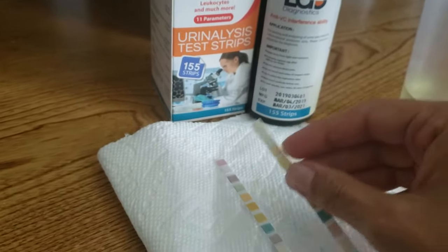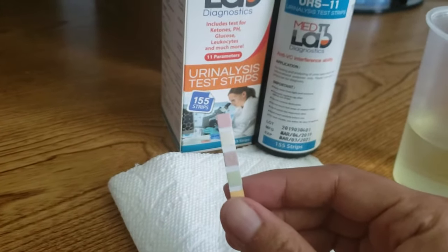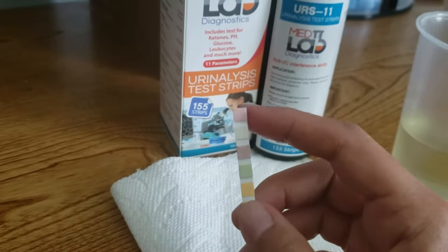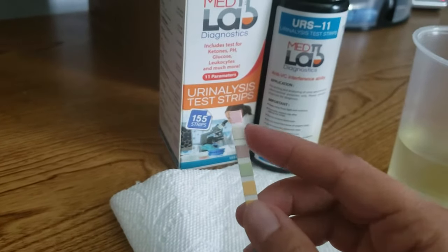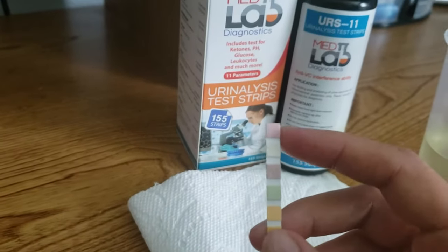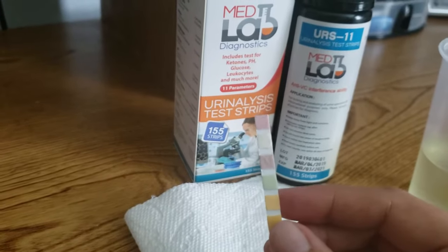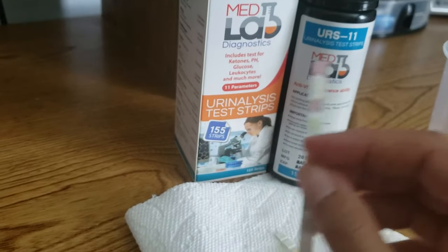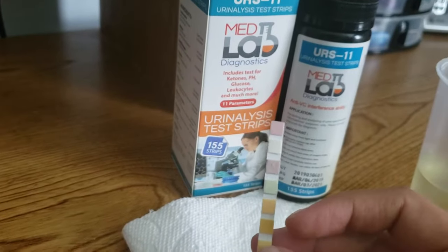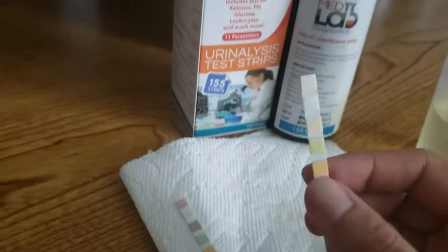When the strips do start to go bad, the leukocyte pad will tend to turn purple. So if you open your can, take out a strip, and the unused strip is already purple, that means the strips have gone bad and it's not recommended that you use them — because a positive leukocyte result looks just like that. It'll turn a dark purple and that indicates a UTI. So you could get a false positive if you unknowingly use a strip that has gone bad. Just do a quick quality check: look at that leukocyte pad and make sure it doesn't look purple. Make sure it looks white like this.